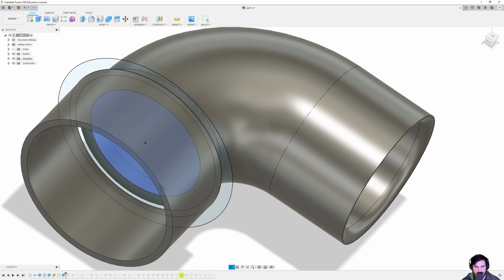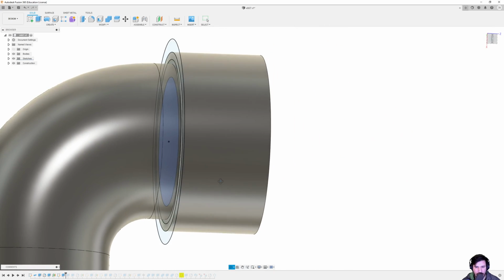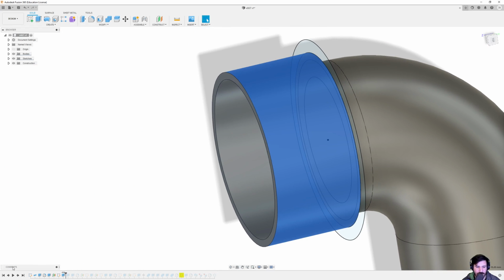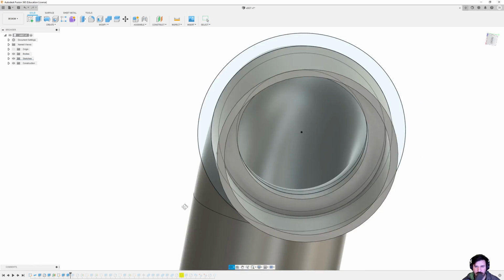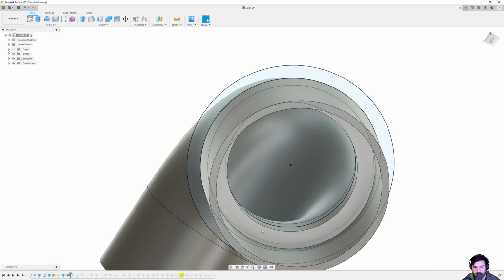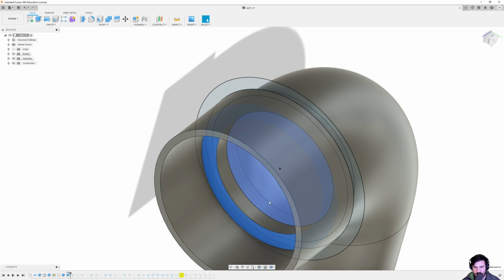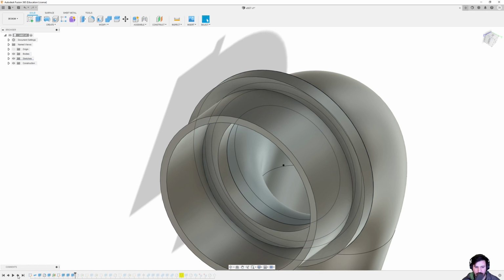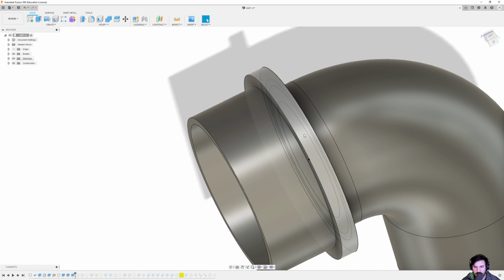So once we extruded that centerpiece, this face right here actually touches the inside of the mask. From there, I extruded the inside piece, this piece right here, to help it mate up with this. And again, that wasn't exactly even, and if I put my hand in there, I can just barely feel it on this model. It's close enough that no one would ever know, A, and B, as long as it's structurally sound, that won't really impede airflow all that much, so that's not a problem.